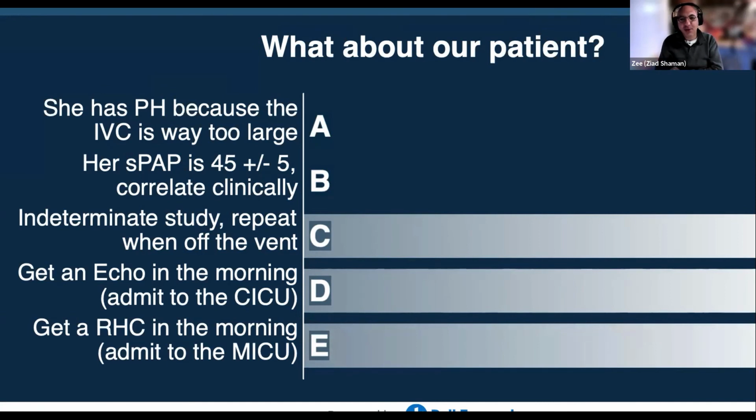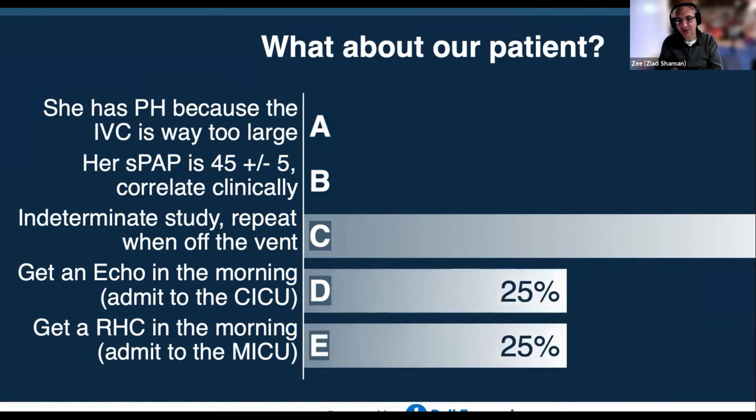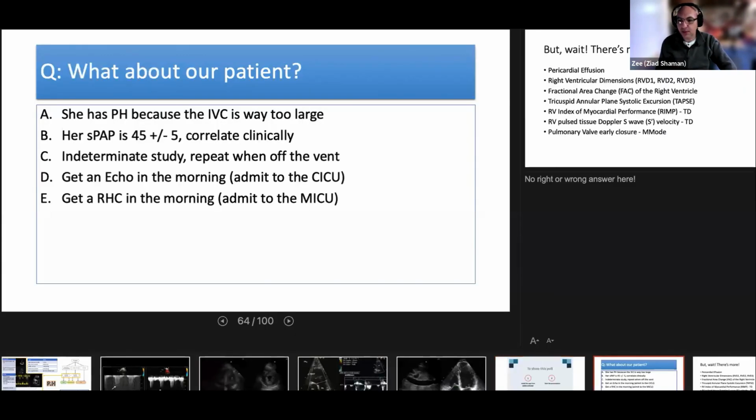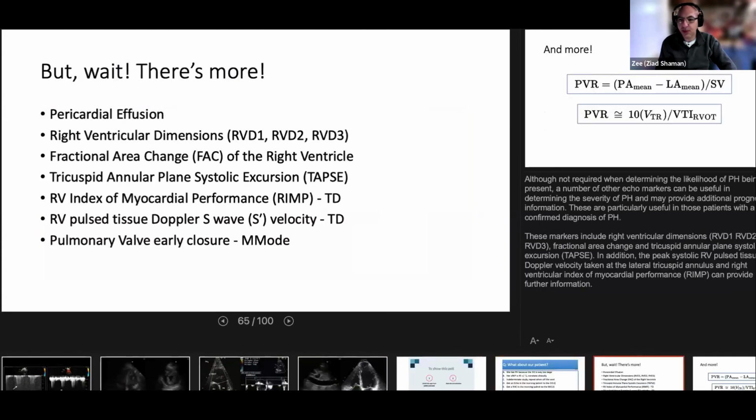Okay, well, there is no right answer and there is no wrong answer, so very good. Like I said, you can't really depend on the pulmonary arterial pressure in this situation.